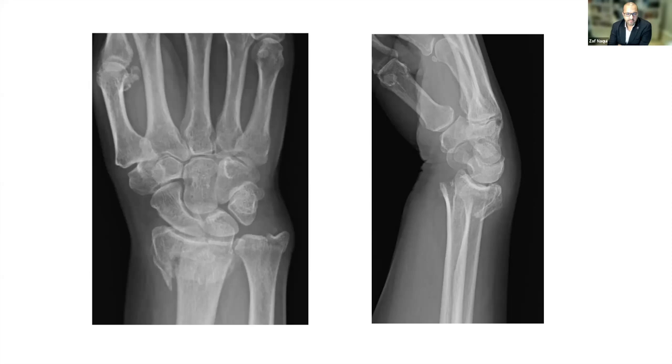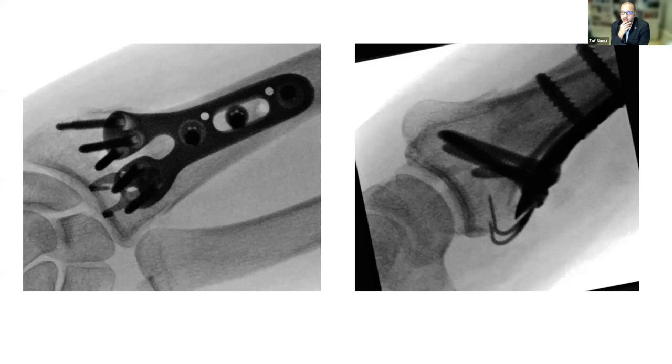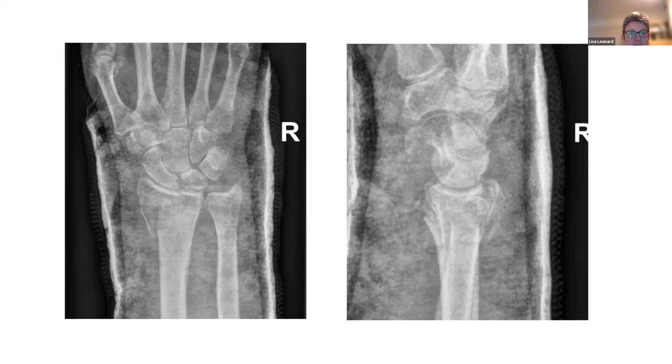So do the screening. That's the post-reduction. And here we go. Then Lisa, do you want to comment upon this? Yeah, so this is actually one of my colleagues' x-rays. I put this in because I agree, Lindsay, it didn't look that bad on the pre-op films, but the lunate facet fragment, if you could just go back to the last film or so maybe, Zaf. The lunate facet fragment is quite small, quite narrow and also quite short, proximal to distal.